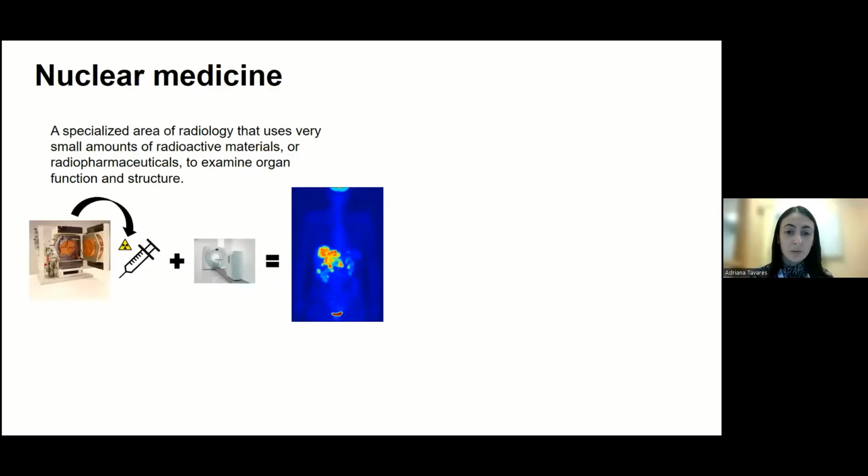And so really the way it works is represented in this diagram here. So we start by having a cyclotron, which is this instrument you can see. Hopefully you can see my mouse moving. So this is a cyclotron image.